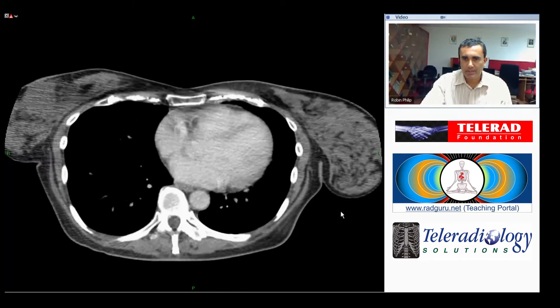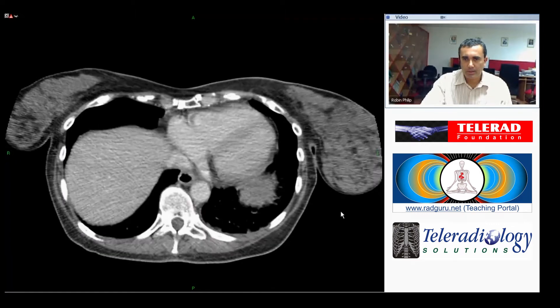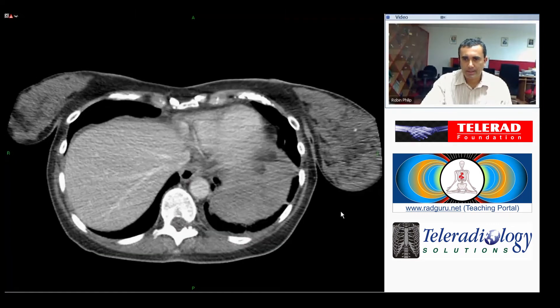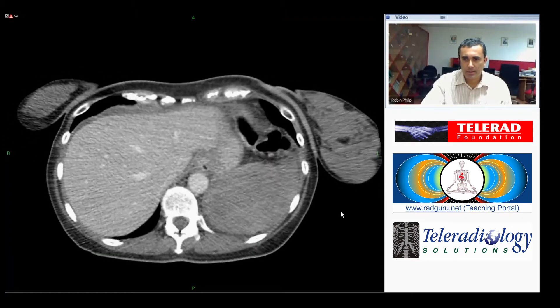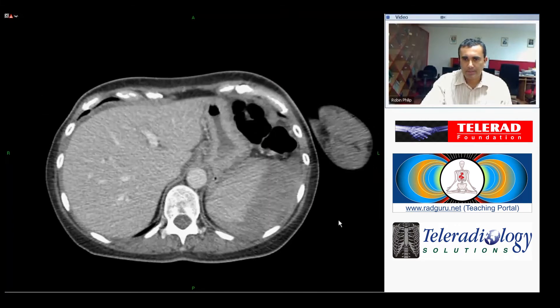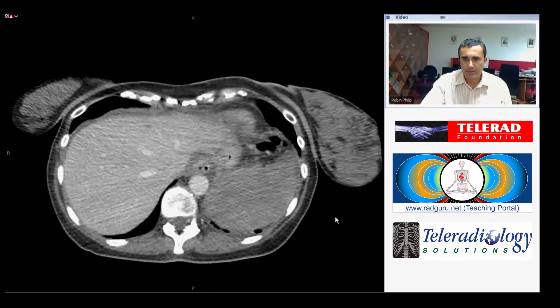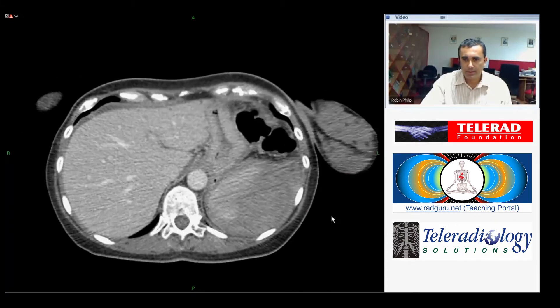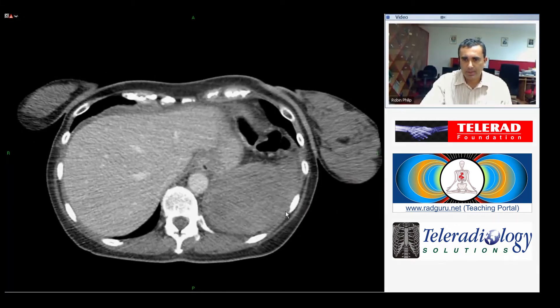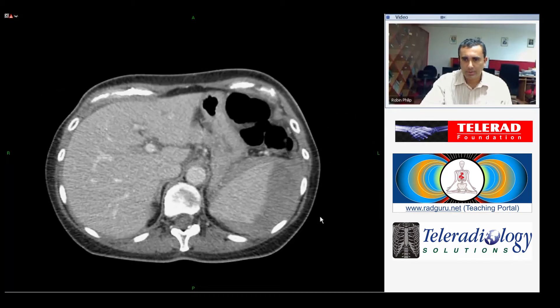As we scan through the lower thorax and the upper abdomen, we start to see that there is a left subdiaphragmatic collection that is extremely heterogeneous with some high-density components to it.